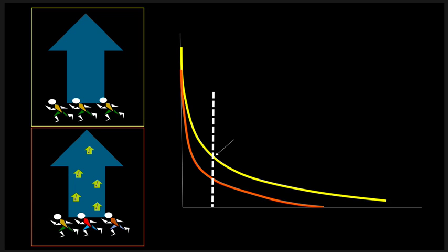So when you've got something that is homogeneous, you're going to see slower dephasing, more signal, T2 bright. And then the opposite is true. Heterogeneous, faster dephasing, less signal, T2 dark. So where I'm going with this is, if you've got a lot of susceptibility, you're going to augment that T2 star effect because it's more heterogeneous, and then you're going to become T2 dark.